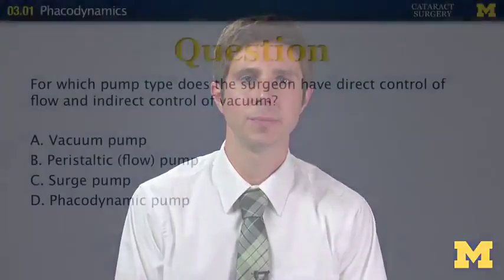So a question: for which pump type does the surgeon have direct control of flow and indirect control of vacuum?